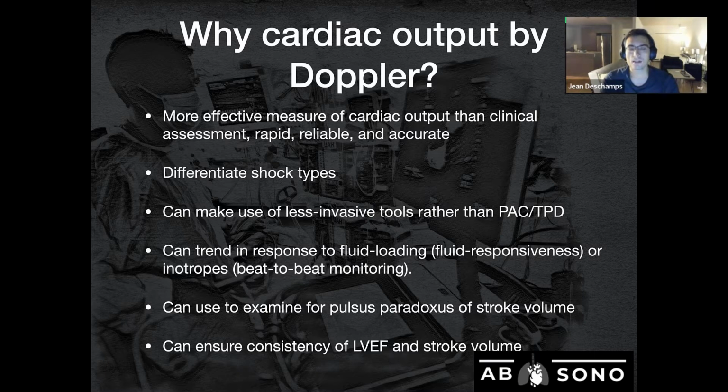I think it's a very helpful method, and it's probably more helpful to me than knowing the EF of the patient, because it's a lot more dynamic and a lot more telling about the hemodynamics of the patient than EF is. Whereas EF can be chronic or acute, the output that's reflected by Doppler actually tells you a bit more about whether or not it works with the patient's condition.